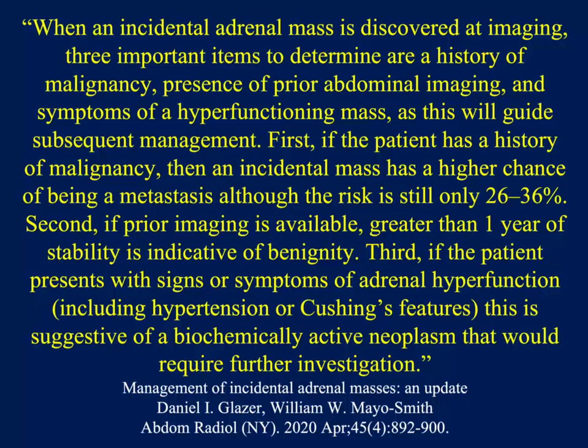Second, if prior imaging is available, greater than 1 year of stability is typically indicative of benign lesions. Remember, a benign lesion can grow under 3 millimeters a year. And third, if the patient presents with signs and symptoms of hyperfunction, including hypertension or Cushing's, this is suggestive of a biochemically active neoplasm that would require further evaluation. So some very good takeaway messages in that.